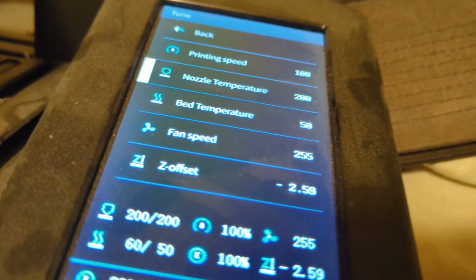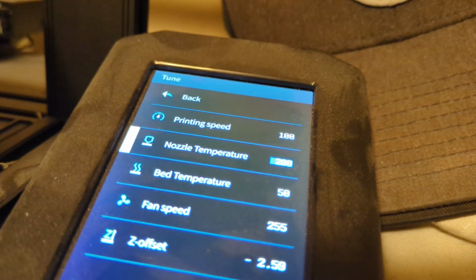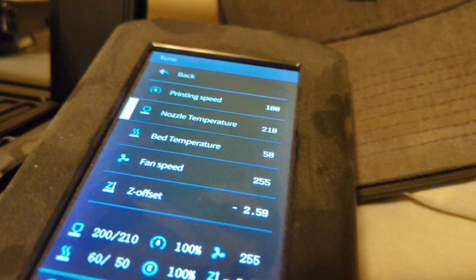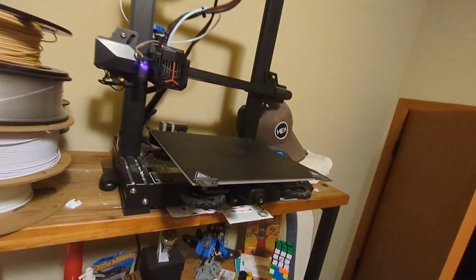I go ahead here and I turn up the nozzle temperature too manually. I probably need to change this in my slicer settings, but I just do it manually. 210 makes it flow a little better for this PLA. And there it is. Printer goes.